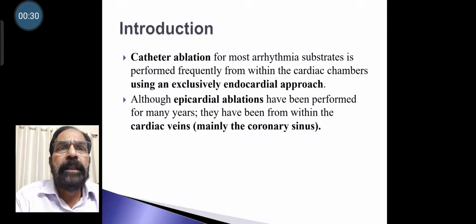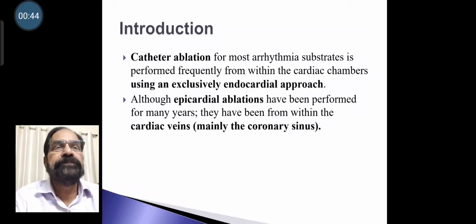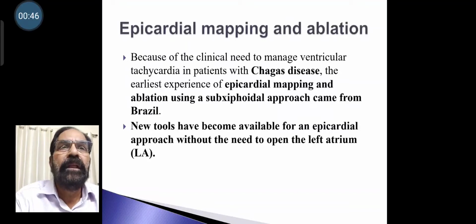Although epicardial ablations have been performed for many years, they have been from within cardiac veins, mainly the coronary sinus. Epicardial mapping and ablation.